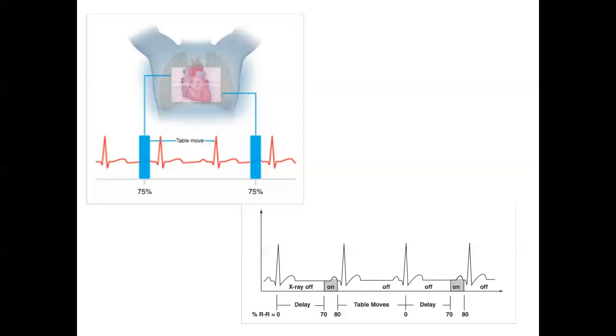Okay, and this depends on how big the heart is, how many scanners there are, how much volume you can cover. So you'll cover the whole heart between whatever, 3, 4, 5 heartbeats.